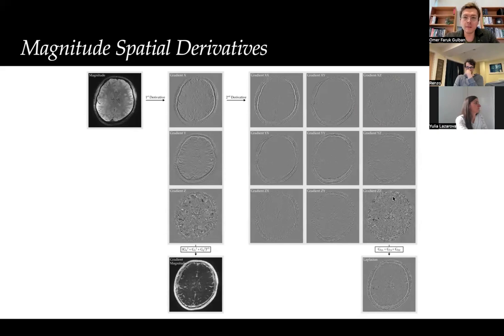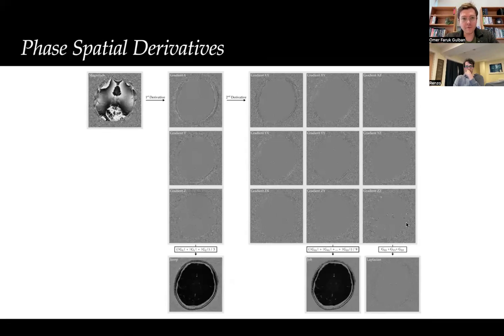So the Laplacian of this image is basically a subpart of this structure tensor. When you sum the diagonal, so gradient x over x, y over y, and z over z, you basically compute the spatial Laplacian. That's it, as simple as that. So what does it mean and how to interpret the Laplacian? Hopefully it will become a bit more clear. At some point we will connect it to fMRI.